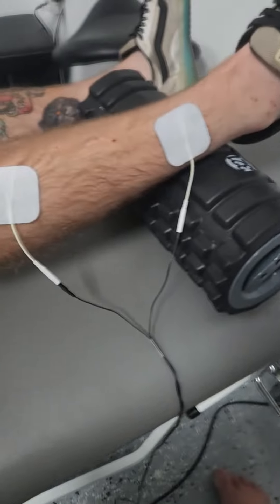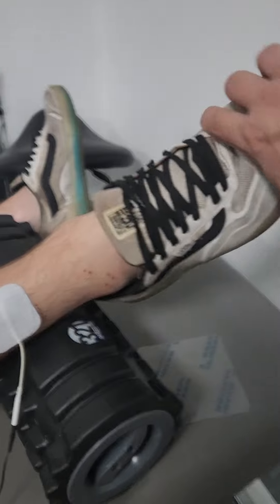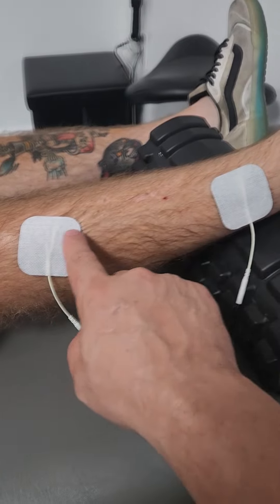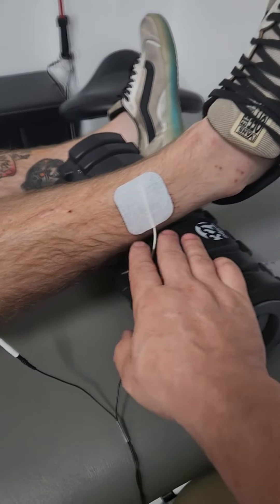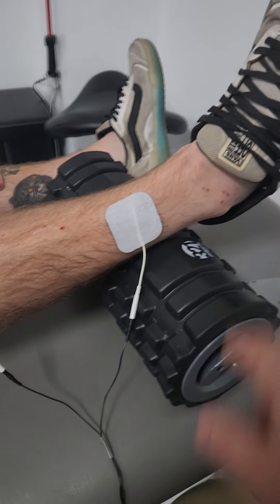There's another motion I'd like you to work on too, which is eversion of the foot — that motion there. The muscle group that controls that are the peroneals, which run just below this tib anterior muscle. The peroneals are here, so you would just take the electrodes, slide them down about an inch or two on both sides, and same setup — you would just turn up the current until you get the eversion of the foot.